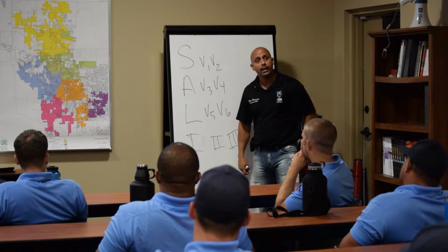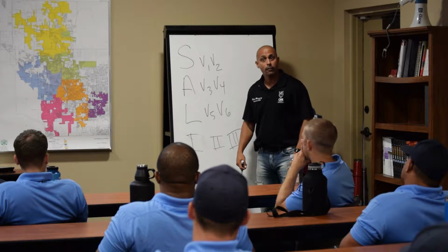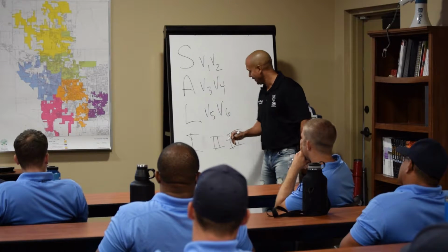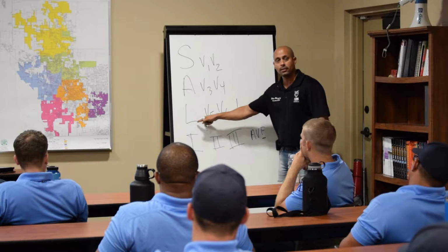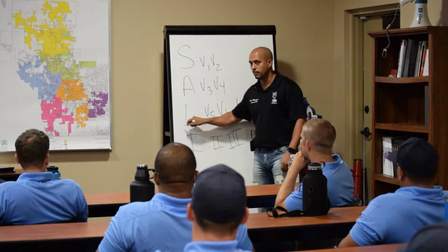What's the only MI that has an F in it? Inferior. That's just got a puzzle look here. AVF. This looks like a lowercase l. And then AVL. L. Boom.